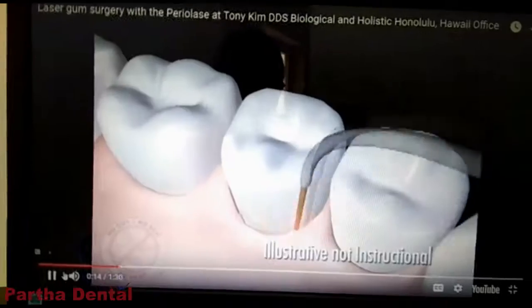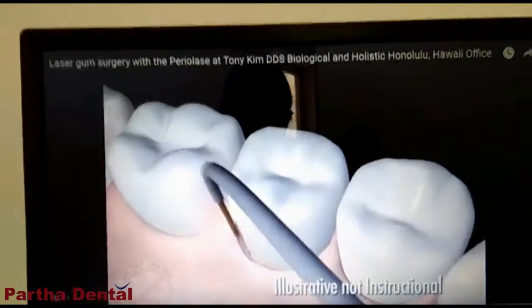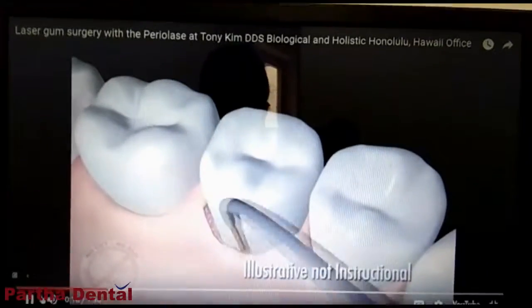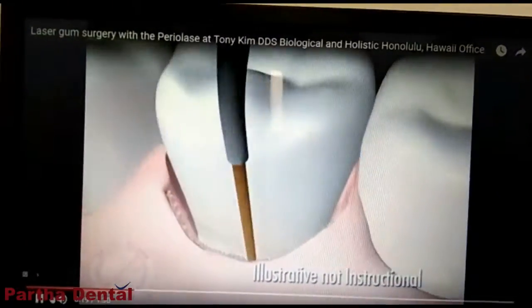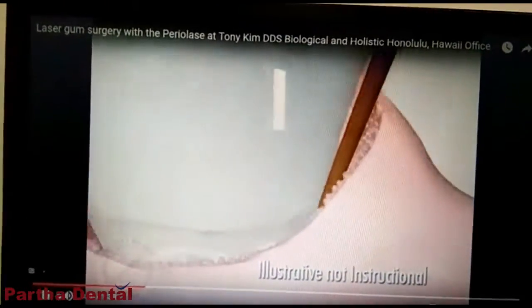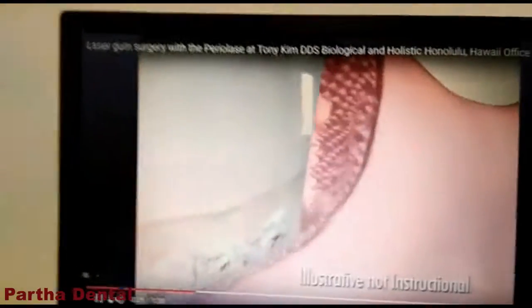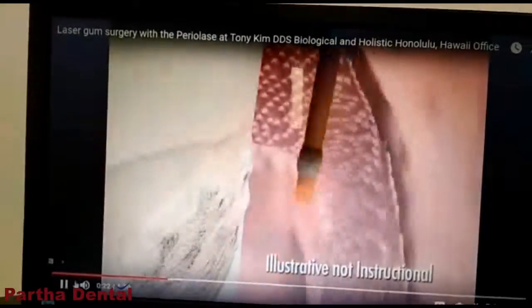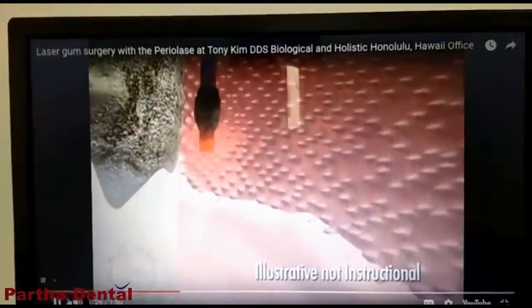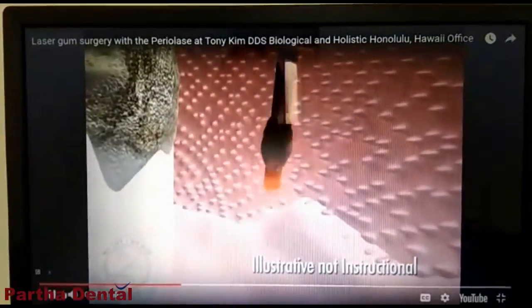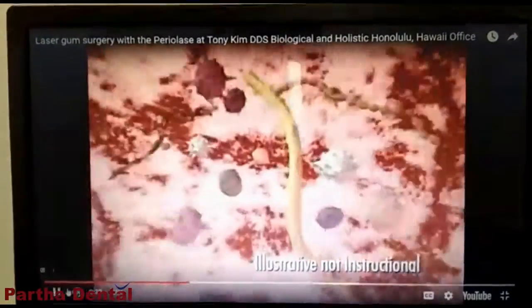Let me explain the laser. If you are watching this video, this is a laser instrument. If you have any infections, we will pass the laser light on the inside of the affected area.